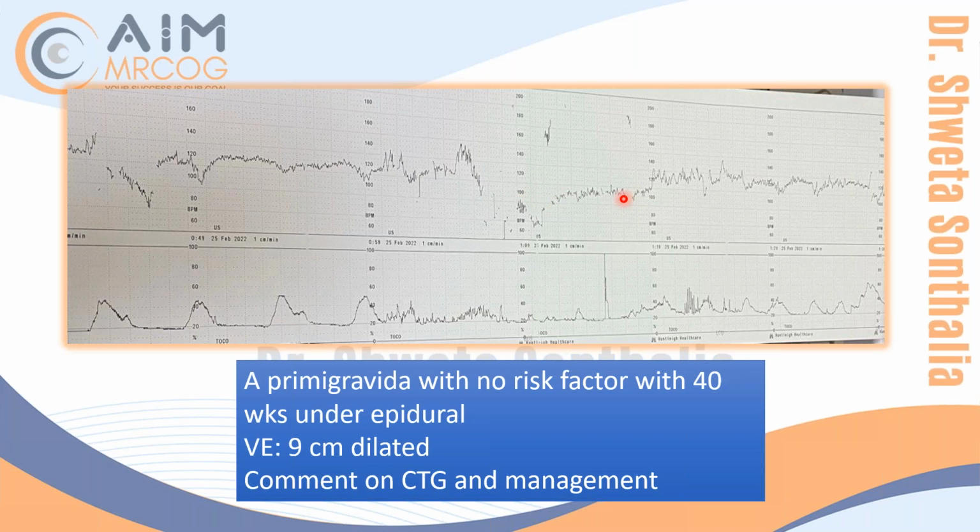So what category will you keep the CTG in? Is it normal, suspicious, pathological? Suspicious, because we need 10 minutes more to reach the conclusion. Yes, so it comes under the suspicious CTG. Why? Now, this is what everybody is seeing.